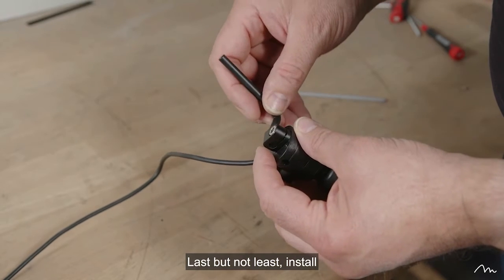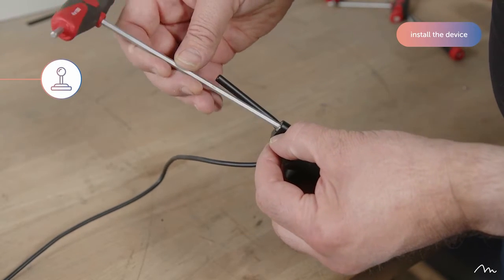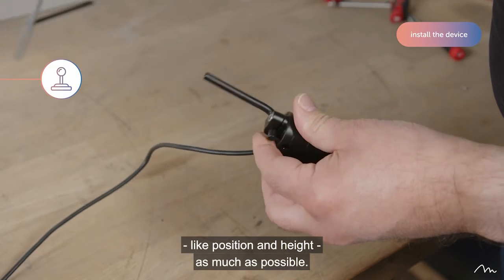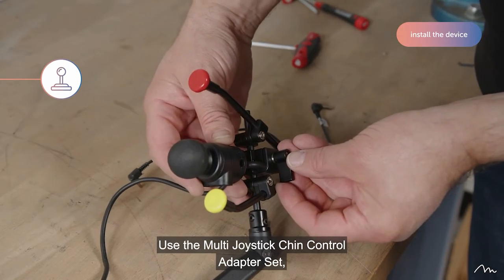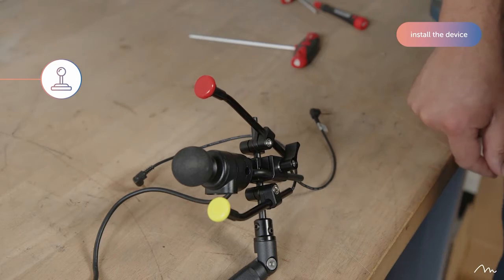Last but not least, install the device, in this case the multi-joystick, on the arm. Try to take into account the specific needs of your customer, like position and height, as much as possible. Use the multi-joystick chin control adapter set, which consists of the multi-joint and the angled rod.